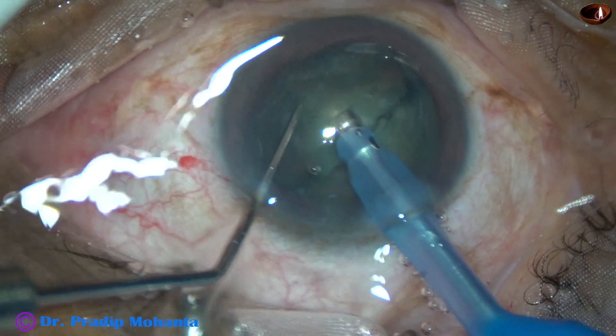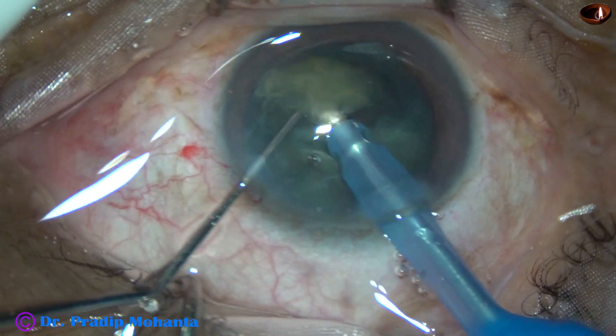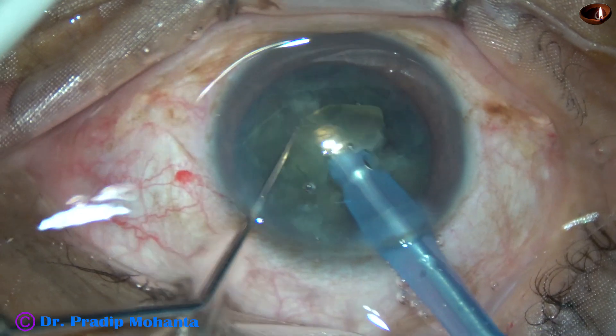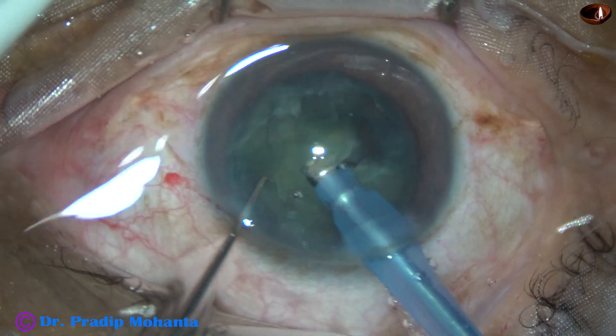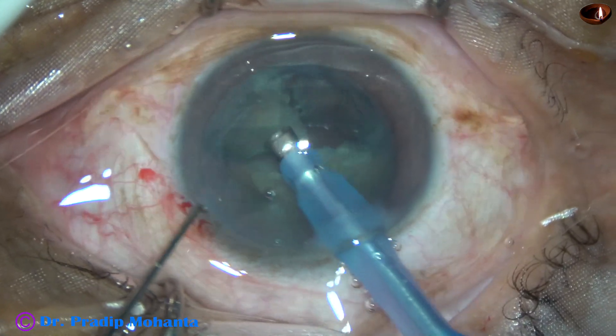Turn it 90 degrees and chop again. Thus one hemi-nucleus is divided into two halves. Now I am emulsifying one piece, then the second piece.